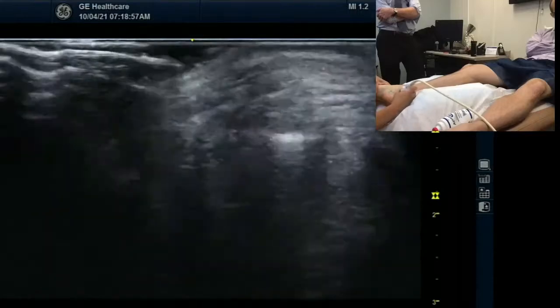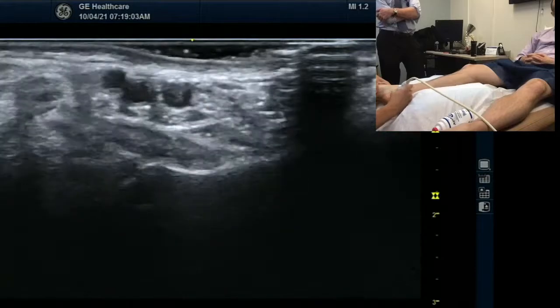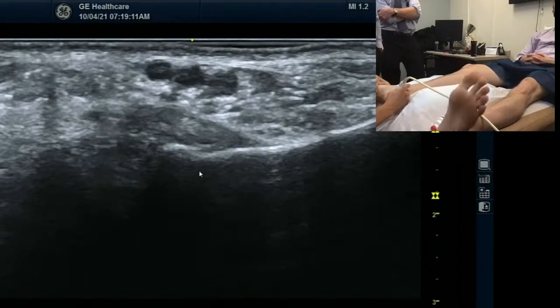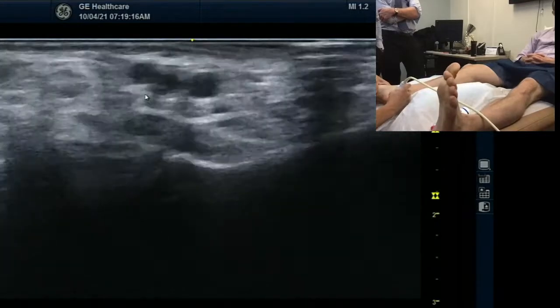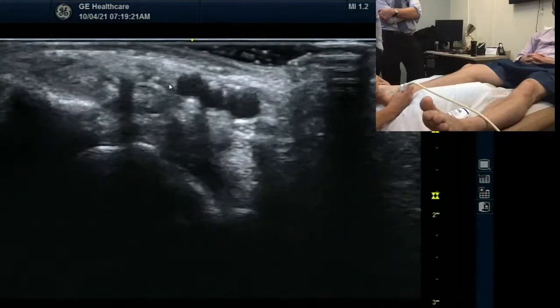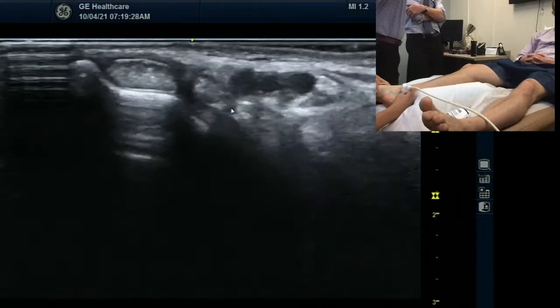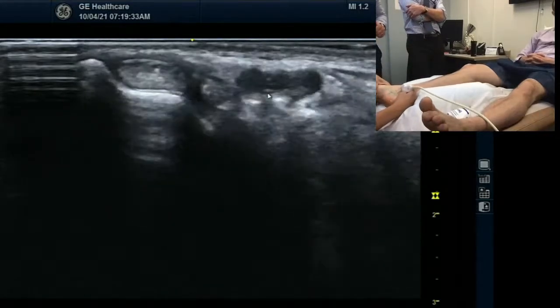But at least here we can see all the structures. I remember it was up towards the top. I see a little honeycomb. I see it — stay there. See a little honeycomb there. This one — try again. Toggle a little bit. I think that's too anterior. Artery nerve. I thought it was to the top right. To the right of the vasculature. I think that's tibial nerve. No, to the right. Bottom right of that? Right there. That's acoustic shadow. Yeah, that's the tibial nerve.